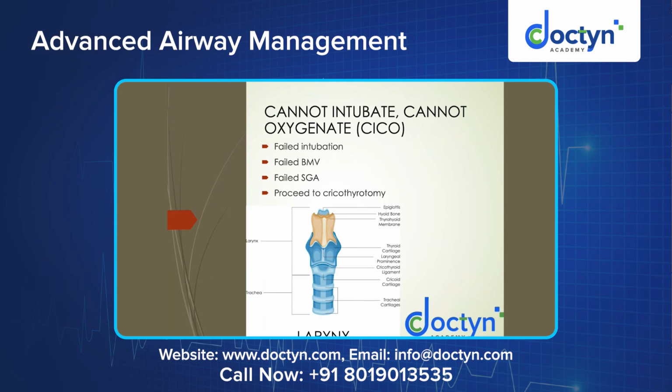So this is the situation where you call can't oxygenate. This is also called complete ventilation failure. So this is what happened: failed intubation, failed bag mask ventilation, failed supraglottic airway device. With any of these, you are not able to improve the oxygenation of the patient. So now you have to proceed to cricothyrotomy.